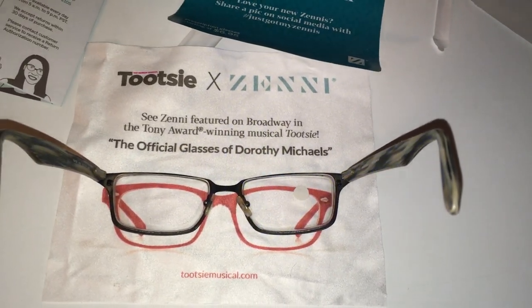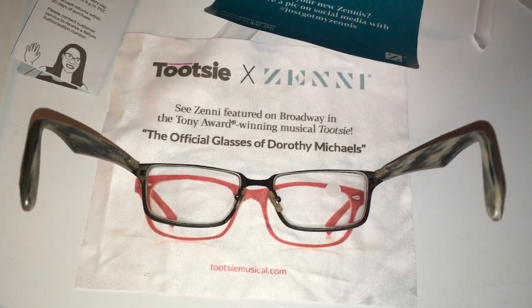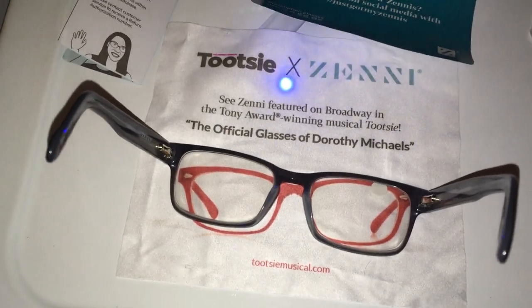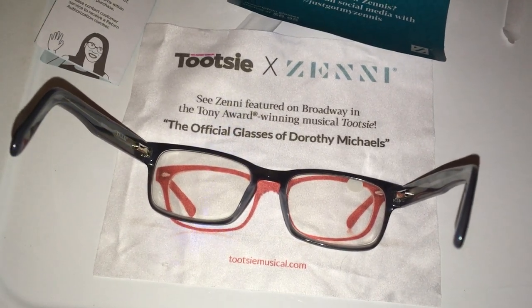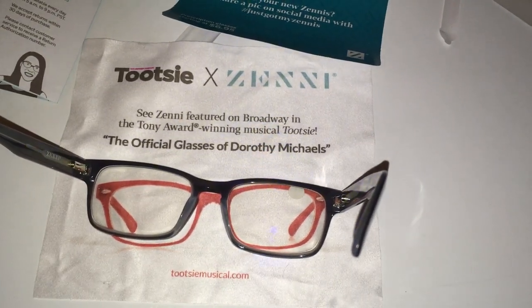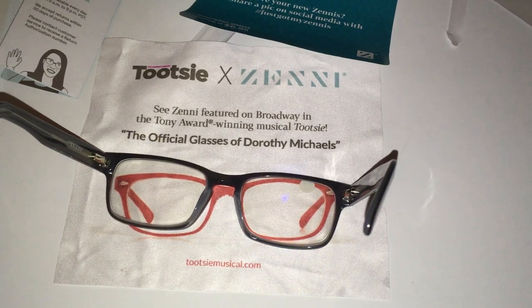And now let's try it with the Zennies — with the blue light blocker-type situation. Here we go with the Zennies. Here comes the diabolical blue light laser. It pretty much disappears — look at that! And the other side... I mean you can see it a little bit. That's amazing.